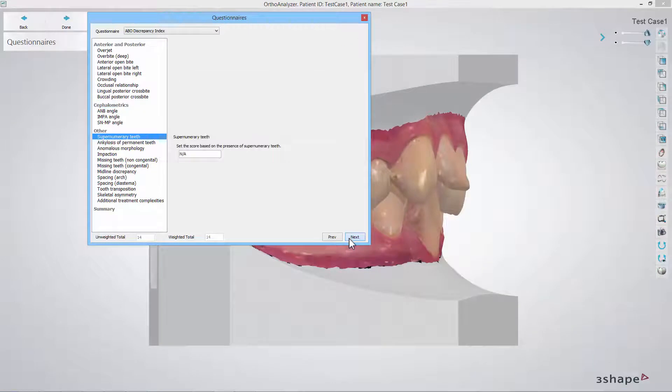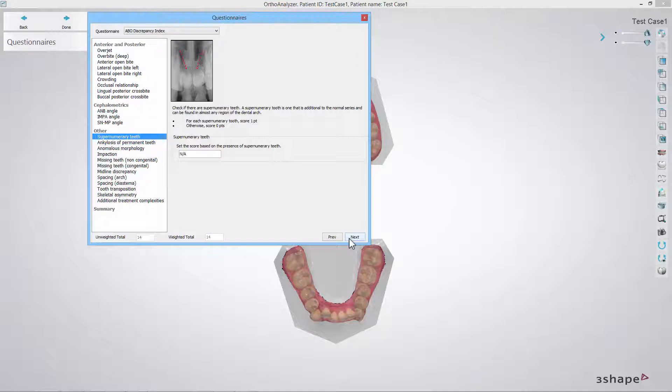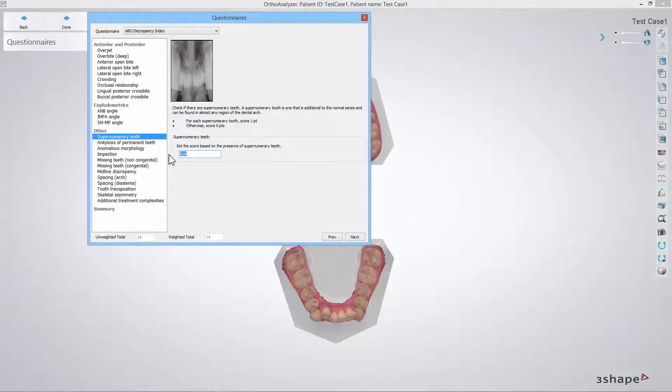In the supernumerary teeth step you should inspect a CT scan of the patient and see if there are more teeth than normal. Fill in the score accordingly. Please remember that this kind of workflow will repeat for the following steps.